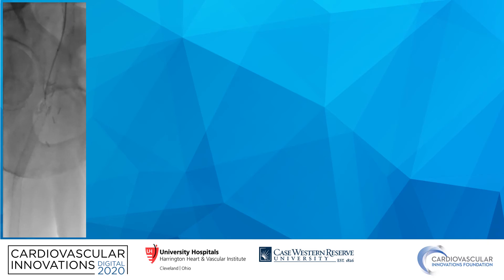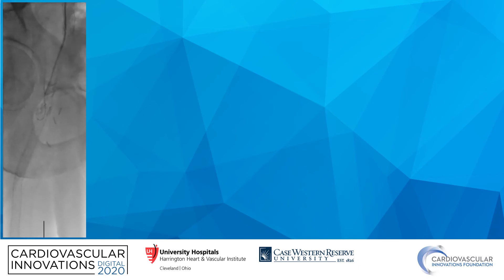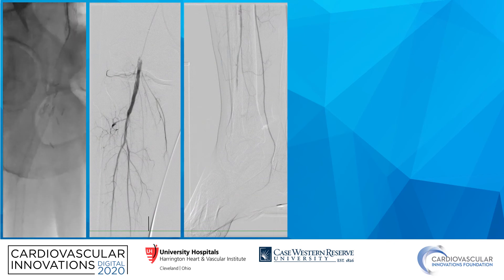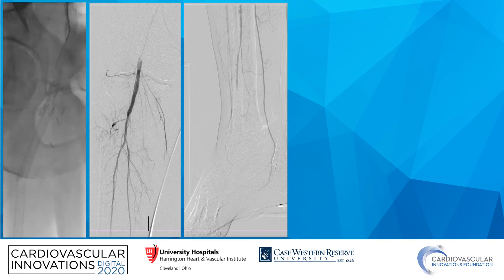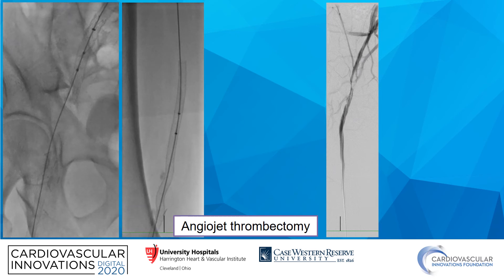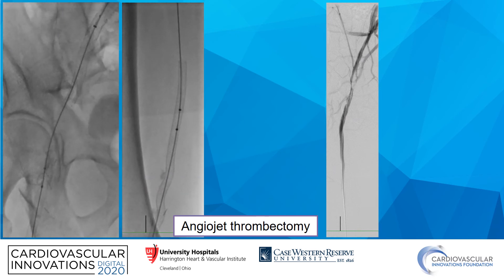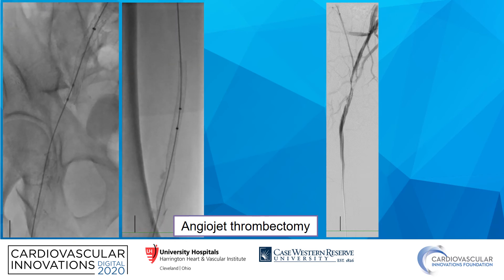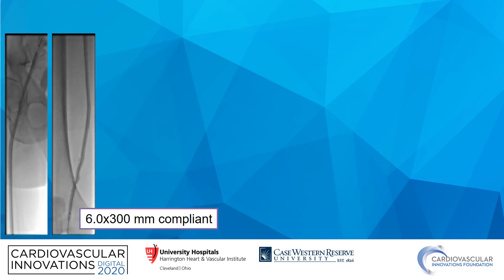We placed the intervention sheath and crossed the occlusion using a stiff-angle glide wire and Navicross. We confirmed true lumen access distally with selective injection into the popliteal artery. Here you can actually appreciate that the PT, which was previously hibernating, has now actually increased in flow. We performed AngioJet thrombectomy using the Solent Omni catheter. Even after the thrombectomy, there was still a significant amount of thrombus within the common femoral artery. We then performed balloon angioplasty of the entire common femoral, SFA, and popliteal artery.